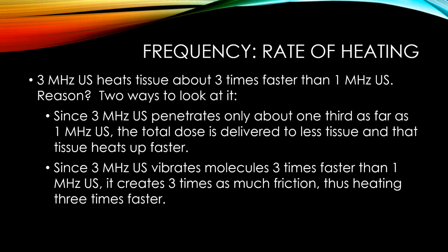Another way to look at it is 3 megahertz ultrasound is going to vibrate the molecules in your tissues about 3 times faster than 1 megahertz ultrasound, and therefore it creates 3 times as much friction in any given time frame and heats the tissues 3 times faster. No matter how you look at it, it's obvious that frequency is a critical component in understanding the heating that is occurring in the tissues.